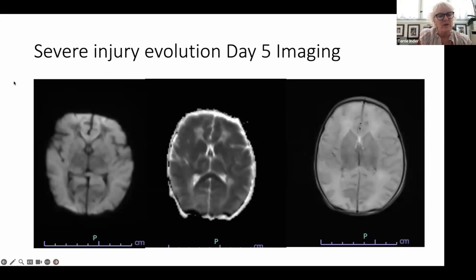Again, the history was one of placental abruption, actually, with this young mother. And this baby also had profoundly suppressed EEG and a very abnormal exam. And you can see all of the brightness that's lighting up across the entire cortex. And that is also equivalent with this restriction all around the outside of the cortex. And you can see a little loss now of what we call the T2 cortical ribbon. You can see it's kind of smudged out everywhere.